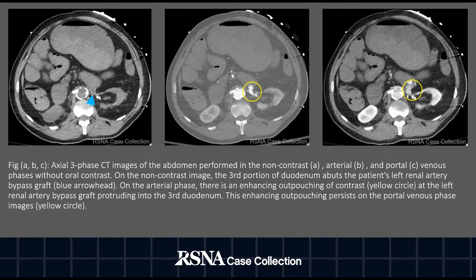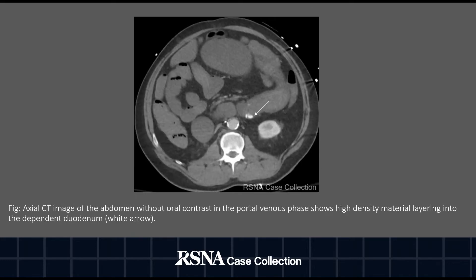This is again seen in the portal venous phase on the right side of the screen, highlighted by the yellow circle. An axial CT slice of the abdomen without oral contrast in the portal venous phase demonstrates high density material layering into the dependent duodenum, highlighted with a white arrow.